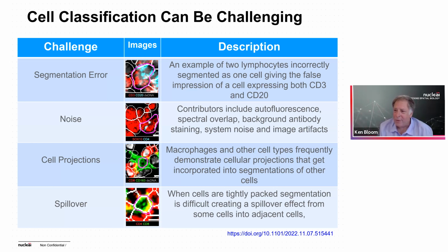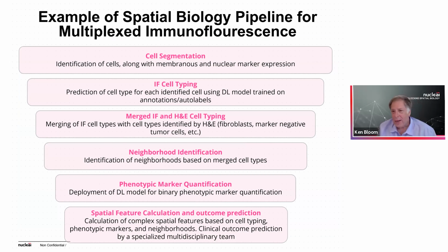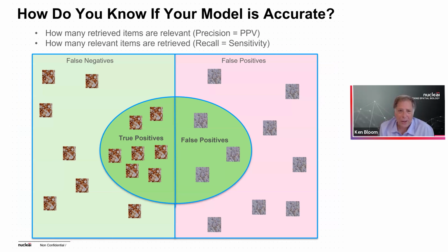So you really need intense algorithms, pipelines, just like NGS. The value of those next generation pipelines to do things like copy number variants, large indels, et cetera, needed to be developed. And at Nuclei, we've recognized the same thing, and the pipelines become absolutely critical. So, for example, we've developed what we would consider the next generation pipeline for multiplex immunofluorescence to overcome the problems that you get when you look at an MIF slide. I'm going to go into that in a little bit more detail, but to do that, I'm going to have to take you on a little bit of a journey.